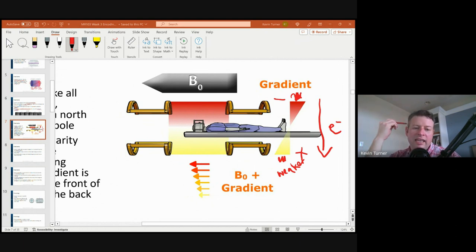Most of the time when you're scanning an MRI, it's not one sound. It's not dun, dun, dun. It's usually dun, dun, dun, dun, dun. There are two tones if you really listen to it. Because the first tone is the magnetic force moving in the positive direction. And then a lot of times we turn around and move it back in the negative, depending on what pulse sequence we're running. So we can do that, and that's called reversing polarity.